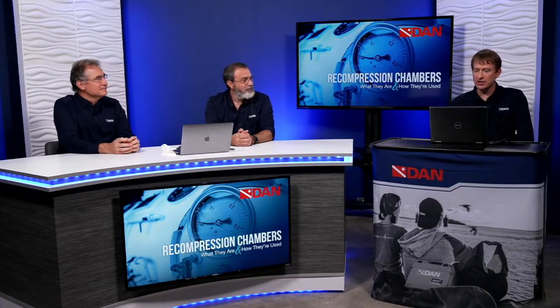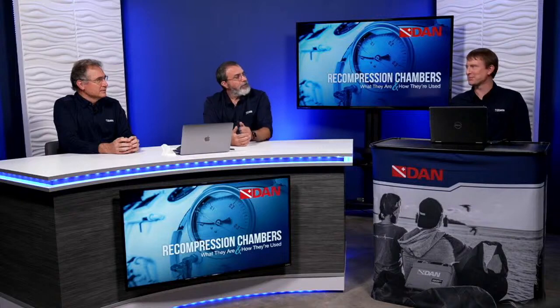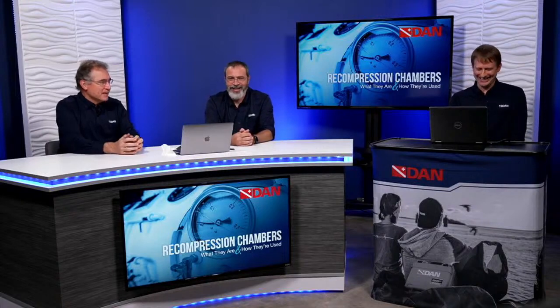Good. Okay. Can you comment on the proliferation of soft chambers and claims to have a maximum pressure of 1.5 ATA? I was hoping that question wouldn't come up. I won't get into the politics. This is a very sensitive issue. Because I've got another one for you. These soft chambers are not essentially medical devices. I know some folks will argue with us. The pressure is too low, Brian.